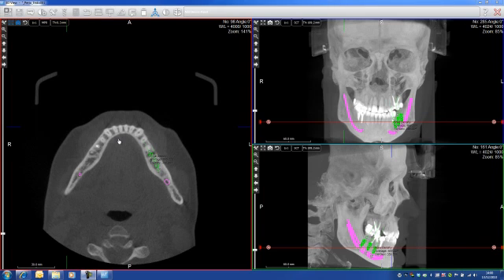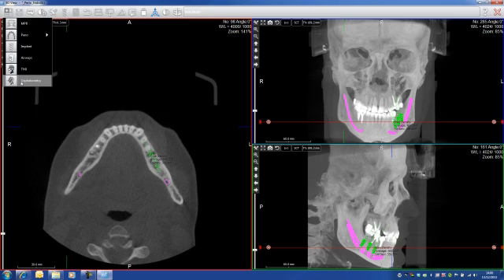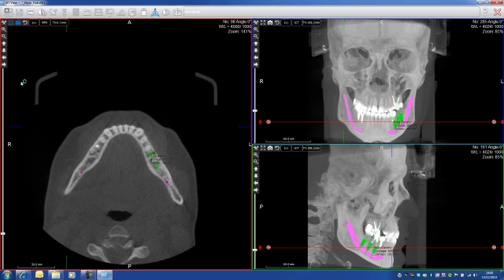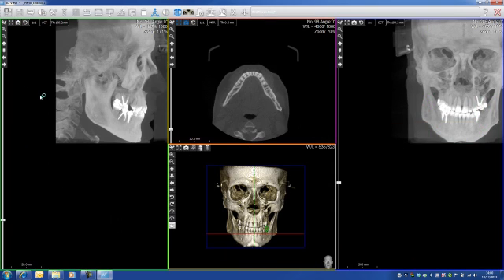Let's see this cephalometric module. This module is designed for orthodontists as well as maxillofacial surgeons. I simply go here, click cephalometry — it takes a little bit of time to load, and here we go.